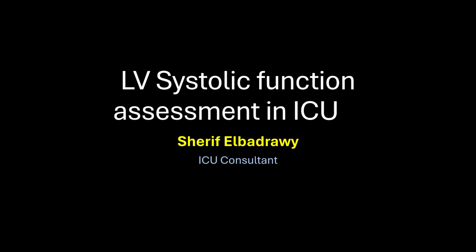Today we are going to discuss the left ventricular global systolic function. And that's one of the most common topics in the ICU, because that's why we pick up the echo probe in the first place: to check our patient's systolic function. So we will try to simplify the concepts about this topic today.